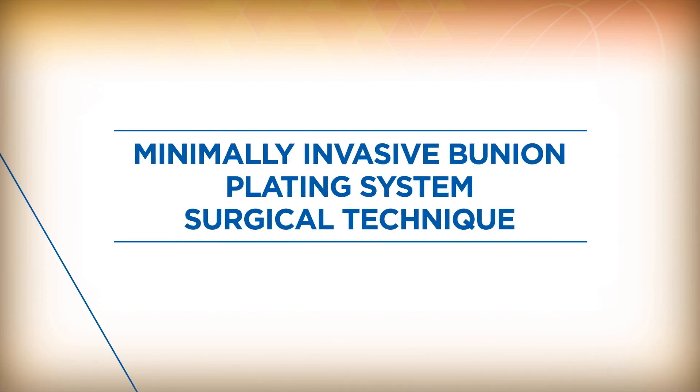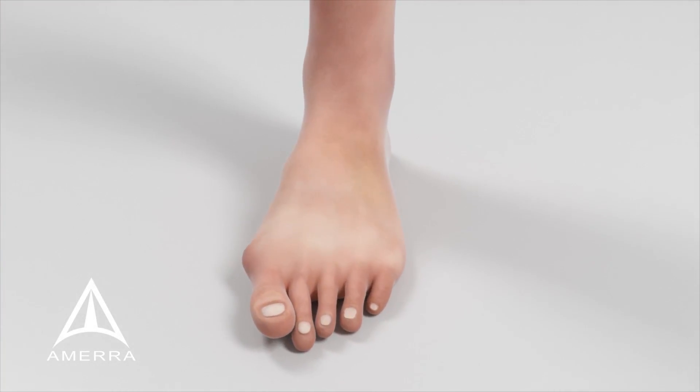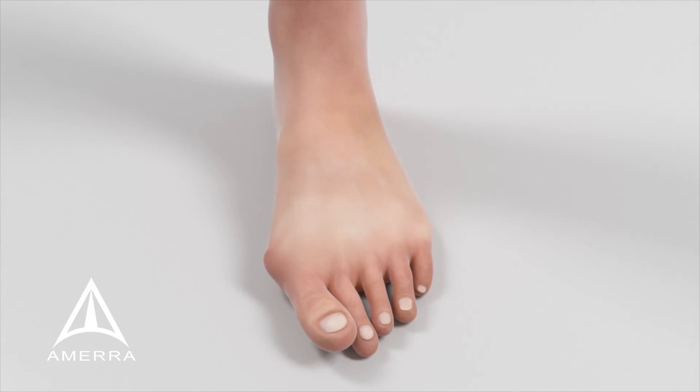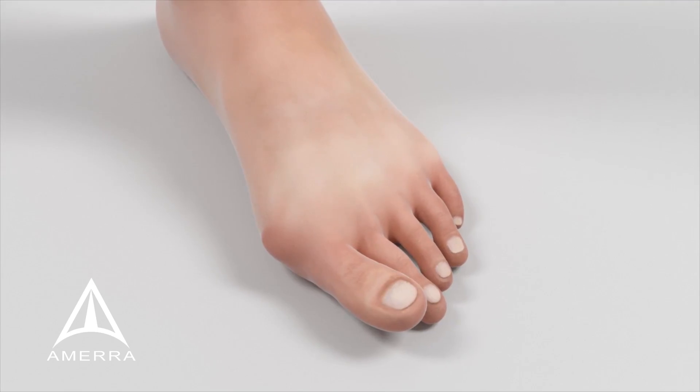Trilliant Surgical's minimally invasive bunion plating system is a unique approach to triplanar hallux valgus correction. The MIB plate is intended to reduce healing time by minimizing soft tissue disruption and providing a quick, solid construct.